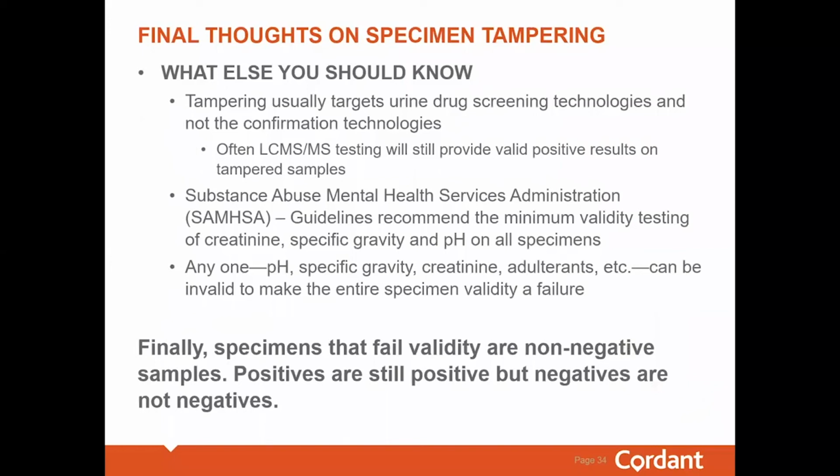What else should you know? Well, here are some final thoughts. Tampering usually targets urine drug screening technologies and not the confirmation technologies. Often, LC-MS testing will still provide valid positive results on tampered samples. The guidance from the Substance Abuse and Mental Health Services Administration recommends the minimum validity testing of creatinine, specific gravity, and pH on all specimens.